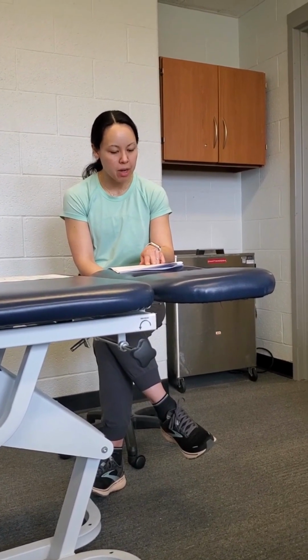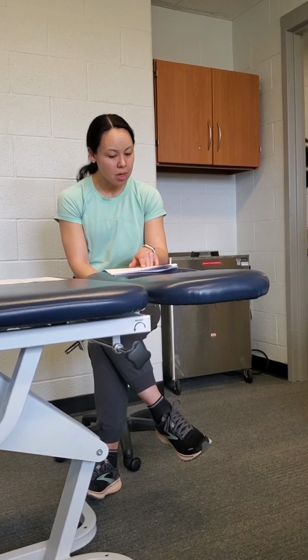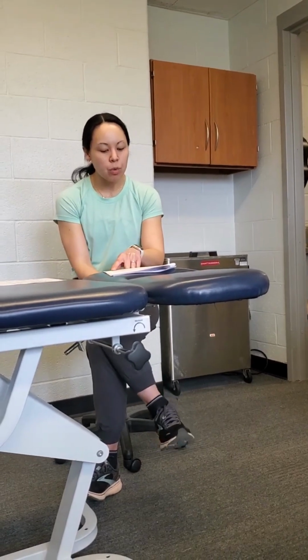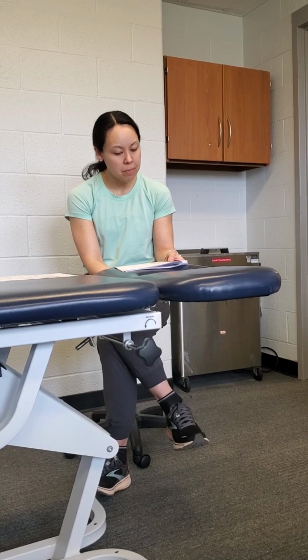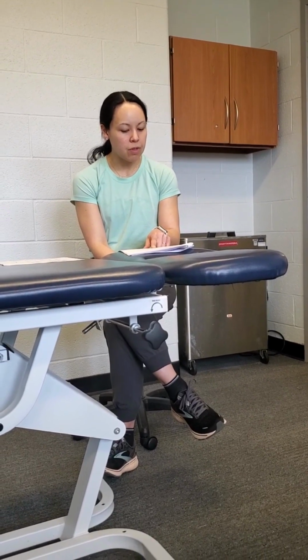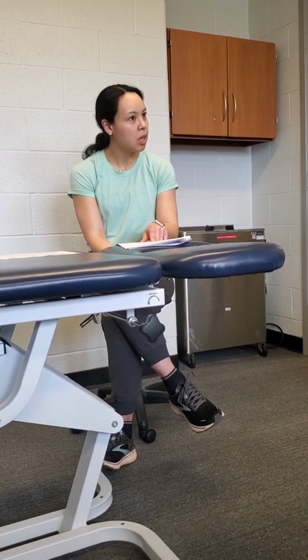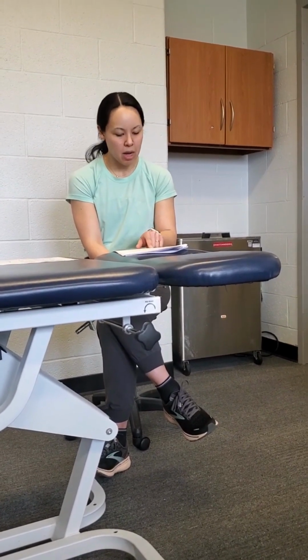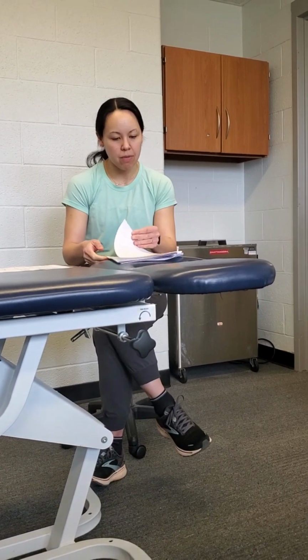You can place the tourniquet on the non-surgical limb, or the non-injured limb, for a crossover effect, just like we would do with some of our strengthening in general, if it's too painful for the patient to have it on the surgical limb. And then I just broke down an example of a patient maybe doing some quad sets with the passive BFR, but you can see it's still the same protocol of 30, 15, 15, 15 being how many quad sets they'd be doing, or if even the quad set was too painful, they were just literally lying there and doing nothing. But that would be the breakdown of that.